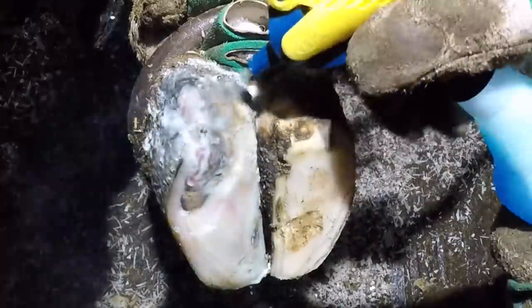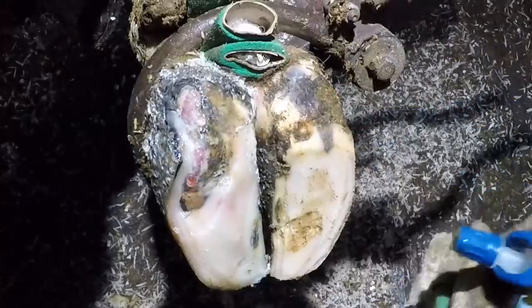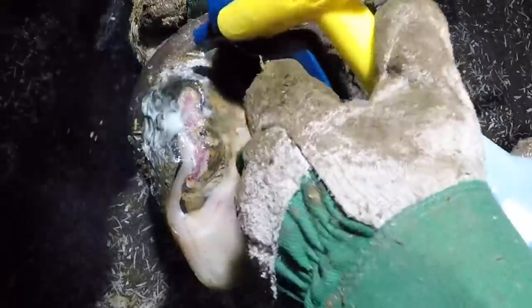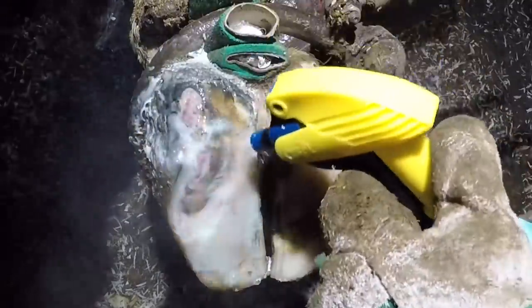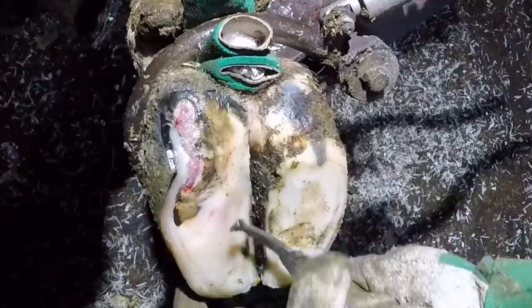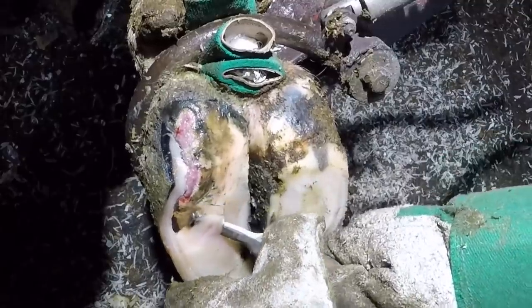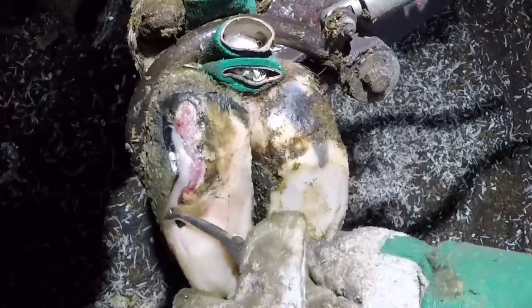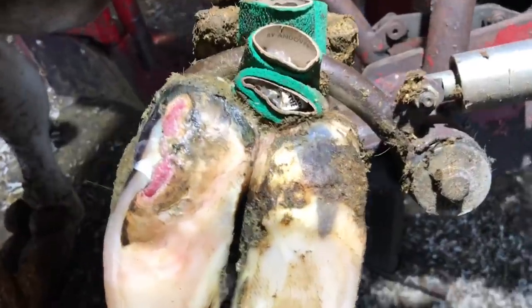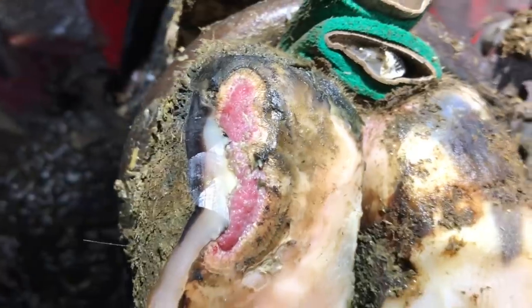As I get these lesions more opened up and more exposed, that's the time that I start cleaning away debris. That allows me to see the margins of what needs to be removed, and I'm also starting to clean this lesion so I can get multiple attempts at cleaning it and spraying it to loosen up any debris and any biofilm that's present from the bacteria that's causing this digital dermatitis here.